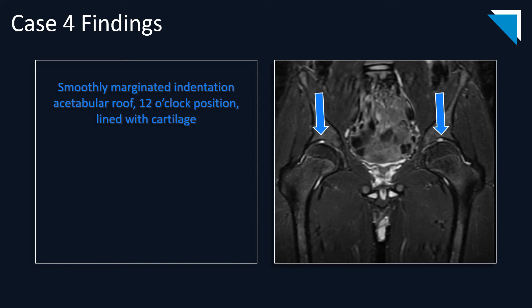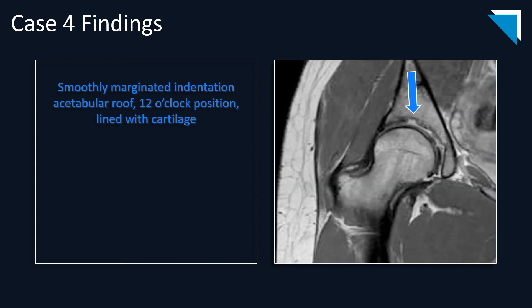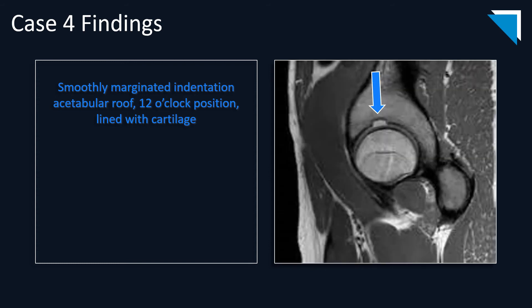Case four is a normal variant, and I do not want you to misdiagnose it, as this patient was. This is a smoothly marginated indentation in the acetabular roof at the 12 o'clock position, lined with cartilage. This patient has the anomaly bilaterally. On a small field-of-view PD-weighted sequence, you can again see the smoothly marginated indentation in the acetabular roof at the 12 o'clock position, confirmed on the sagittal image.